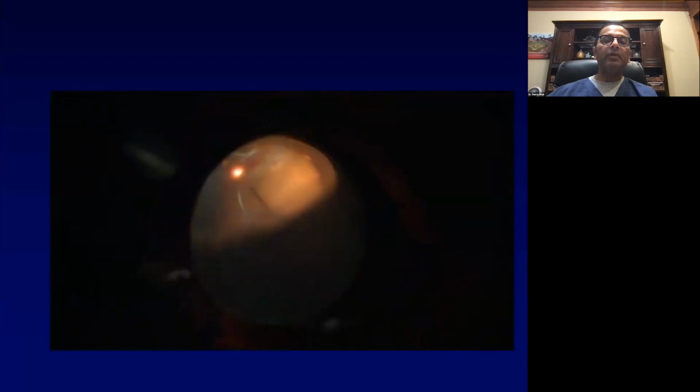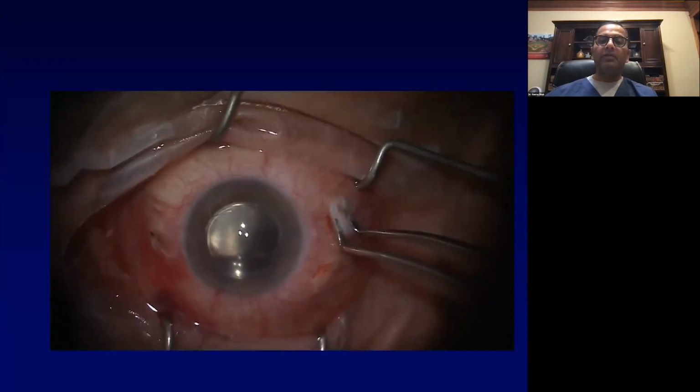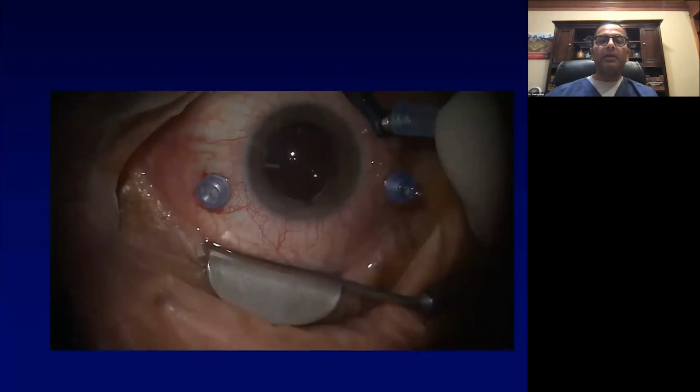You can see that most patients, and here's the breakdown below, get a vitreous hemorrhage for a known reason, but typically tears and/or detachment. This would have been missed and the patient would not have done well. But they've actually done well, with visual acuity improving to 20/20. So again, this is 27 gauge surgery, and I just cauterized the incisions with the conjunctiva over it.